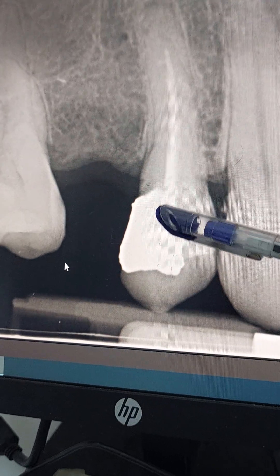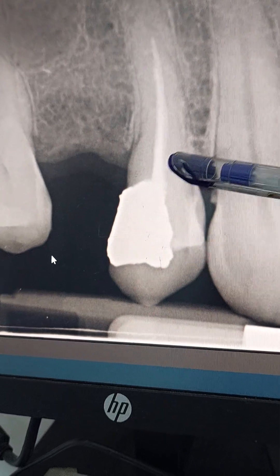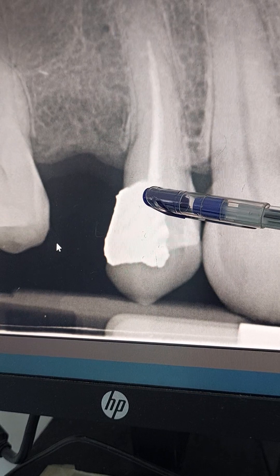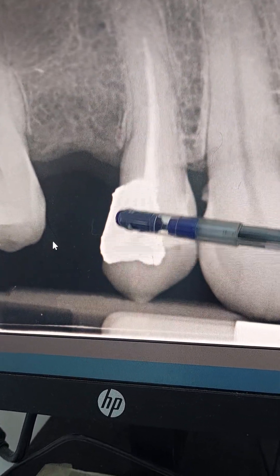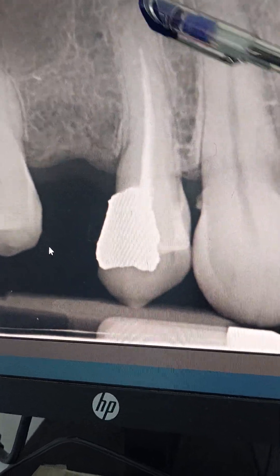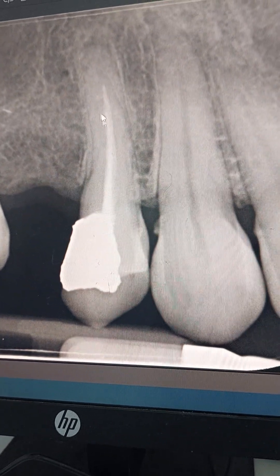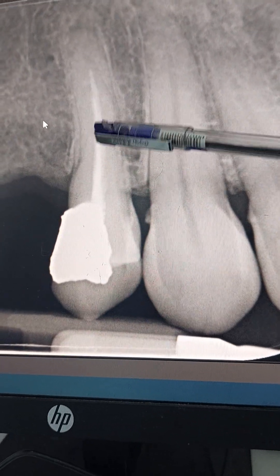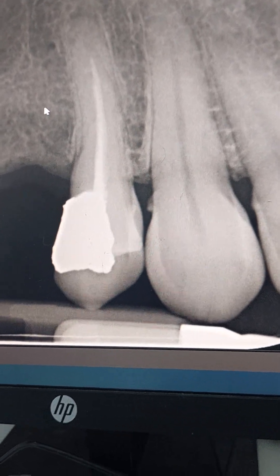Now regarding this endodontically treated tooth — it has lost one or two walls clinically. I can see it here, but I'm not sure about the other walls — whether the palatal wall is missing. The palatal cusp appears to be there. What do you think about this endo — is the filling sufficient? No — and what does the opacity of the filling material tell us?